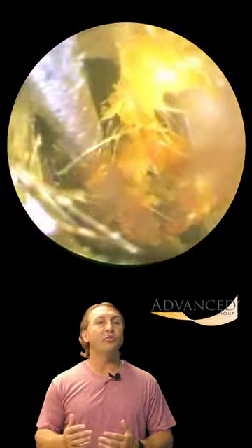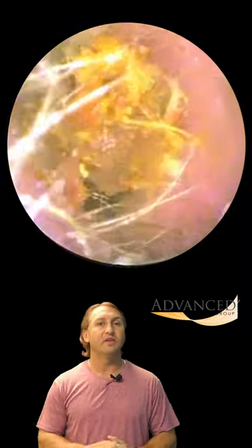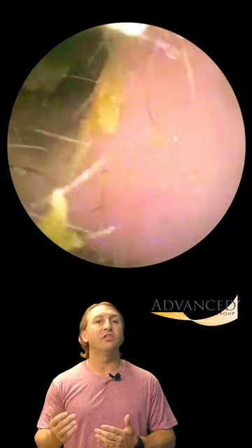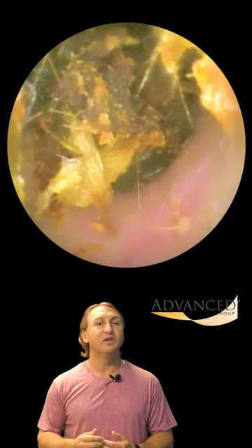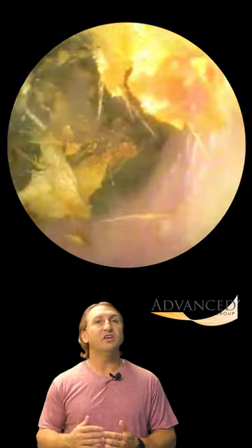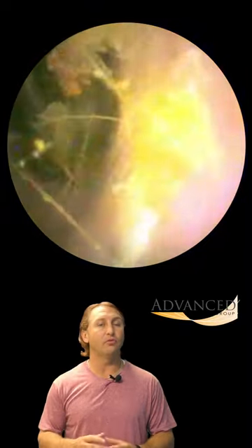In this episode, you're going to watch me use the curette to remove this earwax. This patient had a severe impaction. Unlike in my last video, vlog number 70, I'm actually going to finish the job. We end up using a little bit of irrigation at the end to remove that last little bit of earwax.